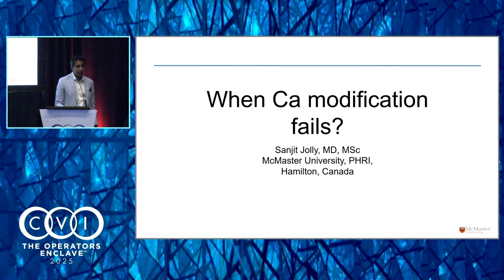And I have had an OPN NC perforation, and they can be bad. I think the important thing is you need to be prepared. Every time I inflate an OPN NC or an oversized NC, I will take a puff, a little injection, and as soon as I see the perforation, I inflate. And then once you've inflated, you stop the bleeding. You can do your ping pong guide.